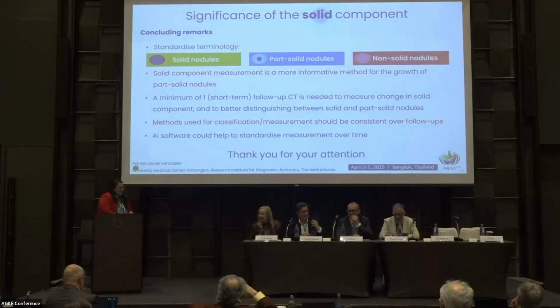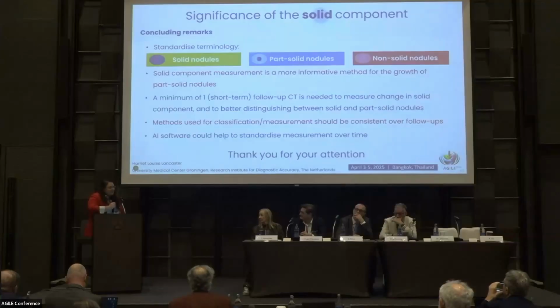I was intrigued because we heard the talk by Mario, who says AI is not really ready to measure subsolid nodules, and you just alluded to that AI may help. Could you discuss that a little bit for us? And I'm also looking at the mean density of the nodule over time. Is this a factor for you as well when you decide whether a nodule becomes denser or a solid part is increasing?